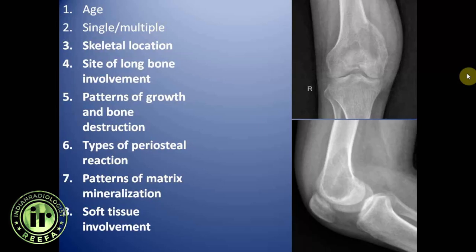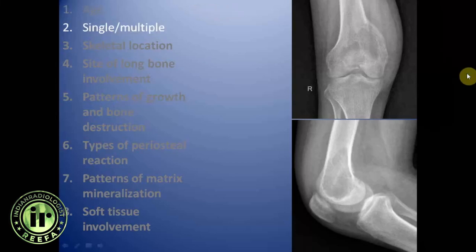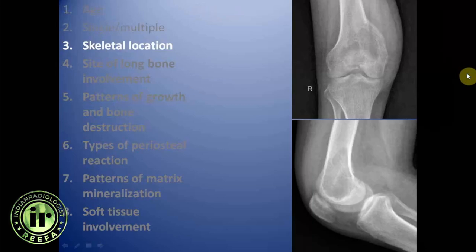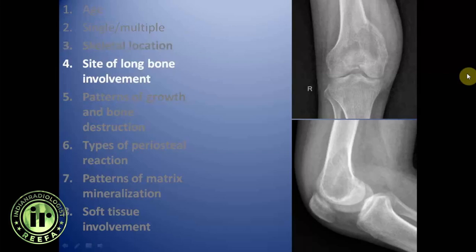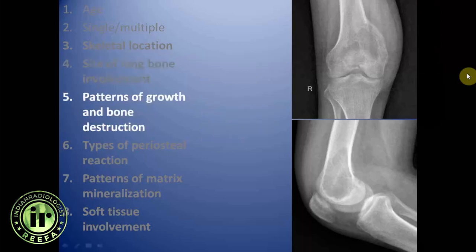Age of the patient is 21 years — a young female, but the physis are closed so she is skeletally mature. The lesion is single, involving the distal femur. Skeletal location is appendicular, involving a long bone. The site of long bone involvement is the epiphyseal and metaphyseal region of the distal femur. The lesion is eccentric, expansile, and reaches up to the subarticular region.